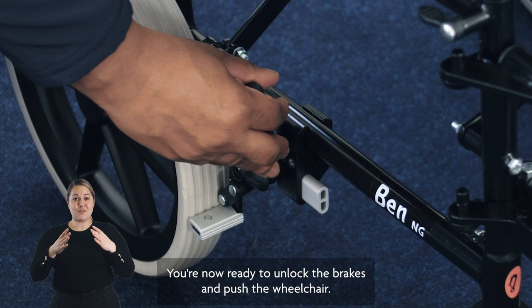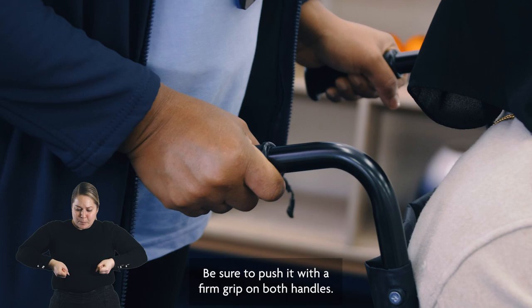Before you try to move it, you're now ready to unlock the brakes and push the wheelchair. Be sure to push it with a firm grip on both handles.